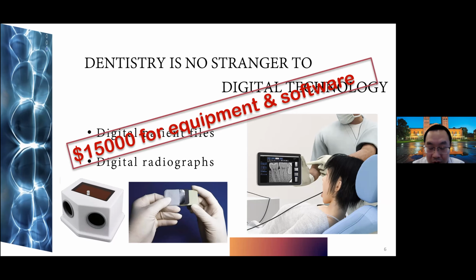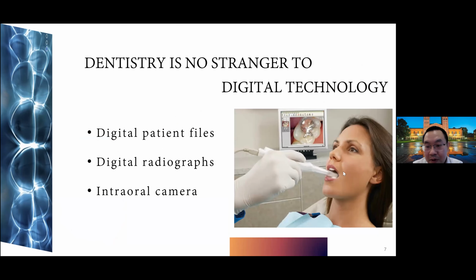Then we have intraoral cameras, right? Intraoral cameras, which is basically a small head camera that is able to scan your teeth and take a photo of your teeth, which about 5-10 years ago was a new, revolutionary thing, where the patients are able to see the restoration, the crack, the cavity, and that's a really good way of convincing the patient to accept the treatment plan.